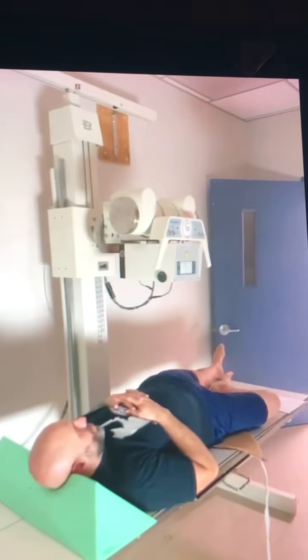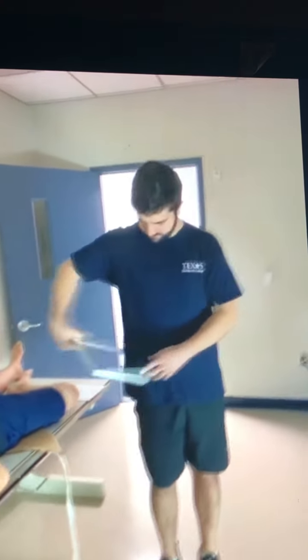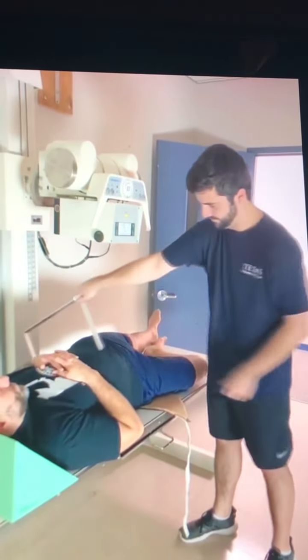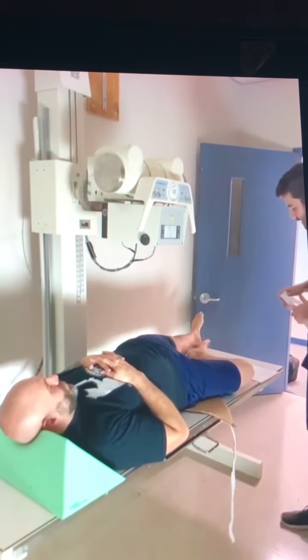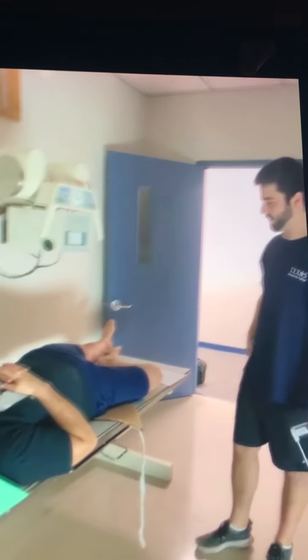This is the last view of this test. So now there's going to be SI joint, AP oblique. Because he's already laying down, I'm just going to measure myself. It's going to be in the sagittal view. What's this view? This is the SI joint, AP oblique view. So he's laying down.